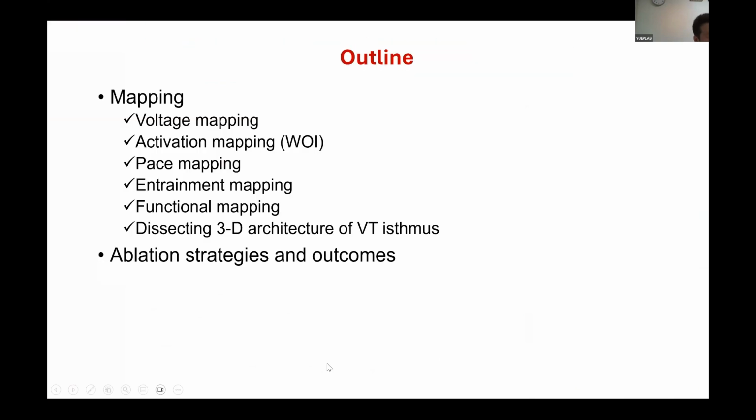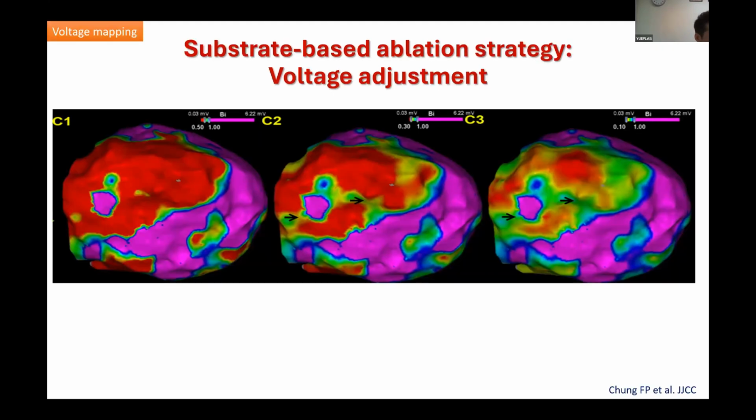So I would like to say that we have several mapping strategies that we could discuss, and for the ablation strategy we could have an open discussion. But later on I would like to focus more on entrainment, because for all of my fellows, entrainment is now very less likely to be used. A lot of doctors do substrate modification, so we gradually forget how to do entrainment, and a lot of people come from entrainment.